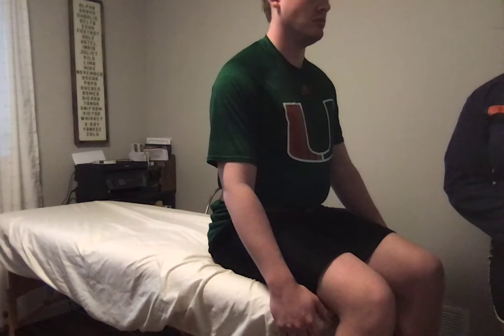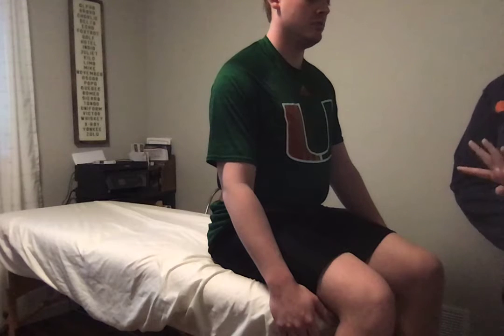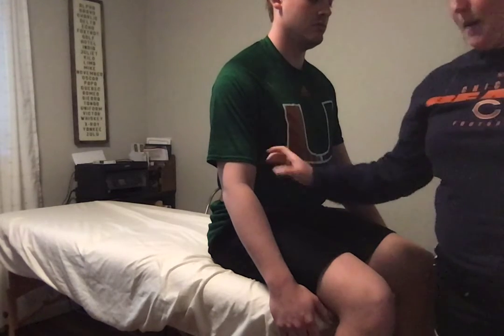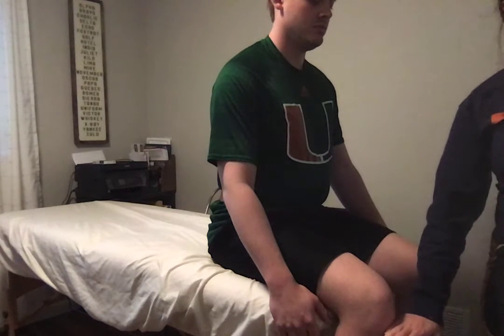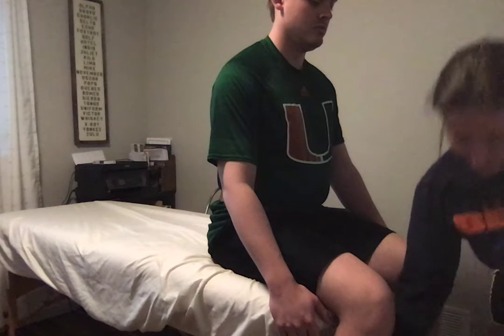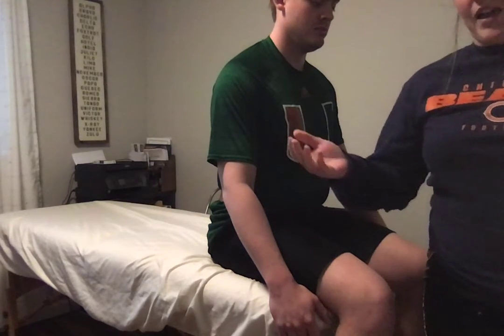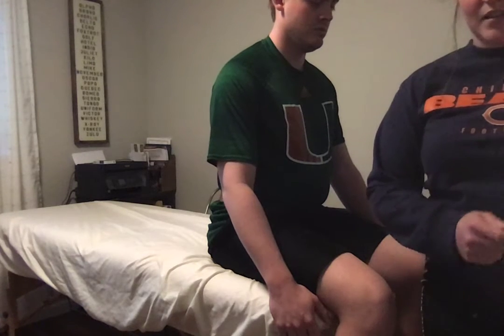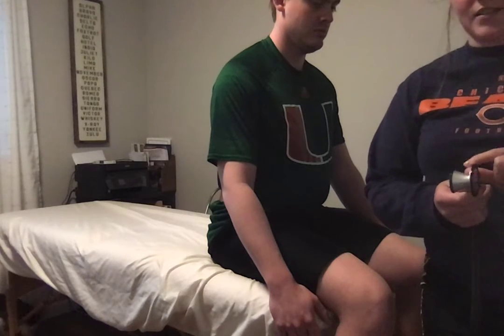Today I'll be going over the DTRs, deep tendon reflexes. There are four tests I'm going to be doing today on my patient: one for the bicep, one for the tricep, one for the patellar tendon, and one for the Achilles tendon. You would need a reflex hammer for this test, but since I do not have one I'm going to be using the edge of a stethoscope.